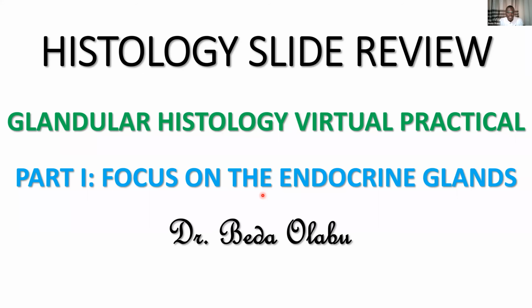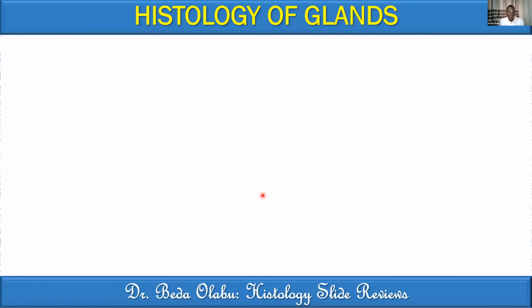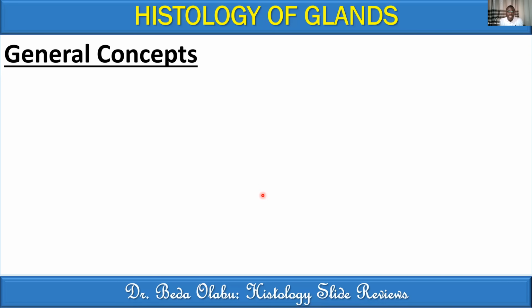For you to understand this, it requires that you already know something about those endocrine glands from a theoretical perspective. And so the lectures that you listen to on the endocrine glands, those 3 lectures capture the theoretical aspects. I'm not going to repeat them. It will just be on a practical, this one. Maybe before we start on those practicals, I just lay down some general concepts regarding the histology of glands in general.